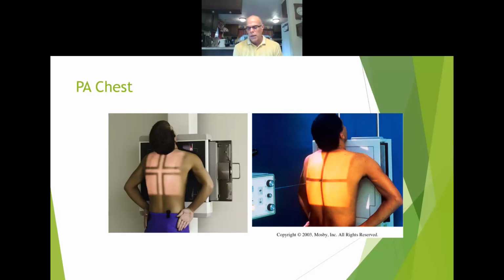The next section talks about radiation protection. It says the shield gonad statement indicates that the patient is to be protected from unnecessary radiation by restricting the radiation beam, using proper collimation first. And then, as you can tell in this little image here, let me get my little pencil going again. I kind of like that little laser pointer. So again, you can see the little guy here. He's got a purple apron on, draped over, hanging on his waist. So that's your second type of shielding, and you also can see the clean collimation square around him. That's going to help reduce his exposure also.